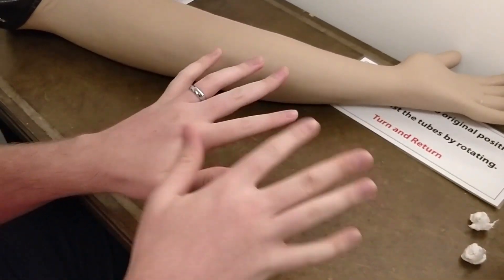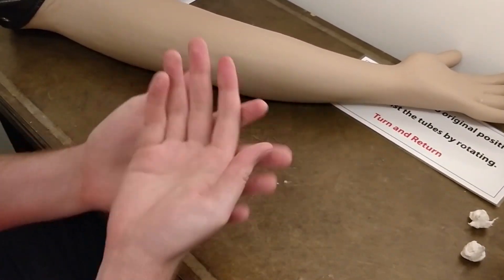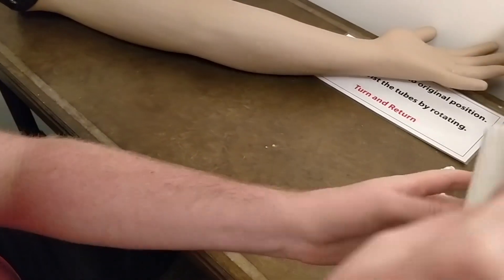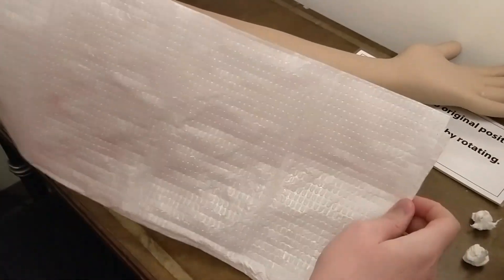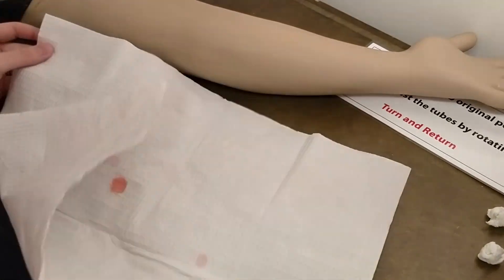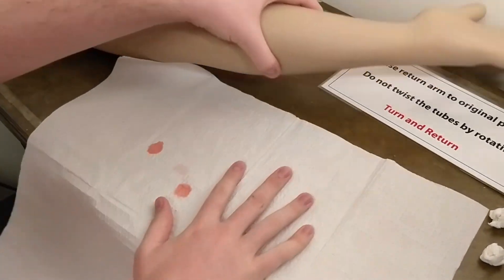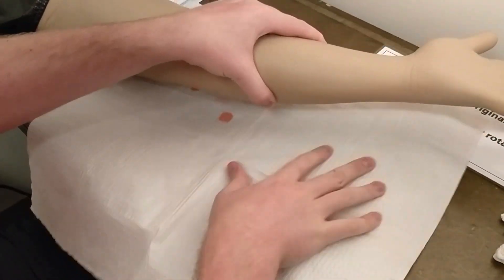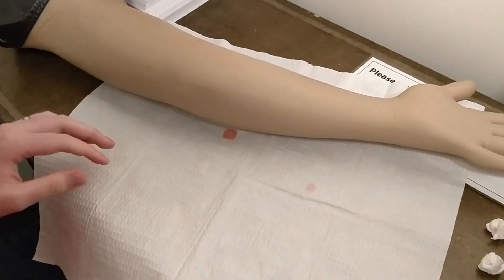After handwashing, make sure to dry your hands thoroughly with no water left on them. Now we will prepare our aseptic field, starting with our drape. Make sure the drape is shiny side down. Keep the arm up and out of the way. Make sure it's fully onto the field — I like to keep it up towards the back so we have plenty of space to prep.